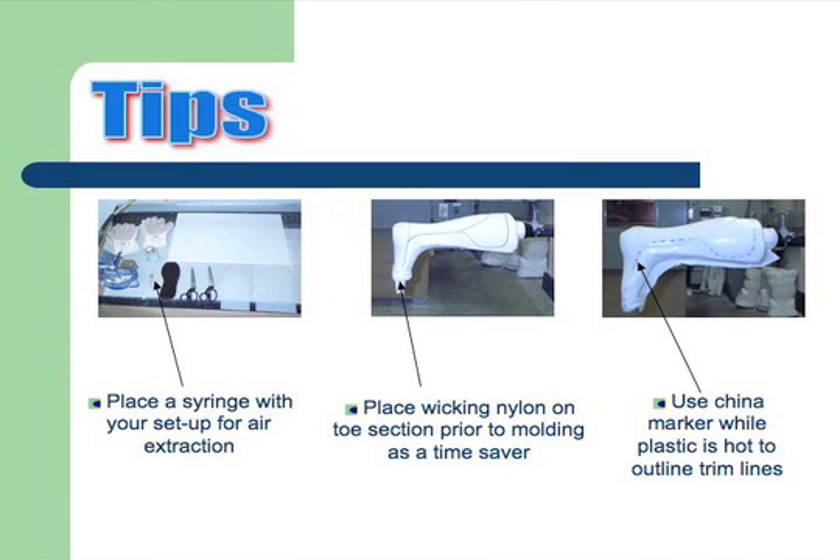Another thing that saves some time: make sure your second nylon is on your cast before you start. You don't want to have to try to pull it over and catch it or tear it — it's just easier to have it on the cast. As soon as your mold is done, highlight your trim lines with the wax marker so you can see them and cut them off.